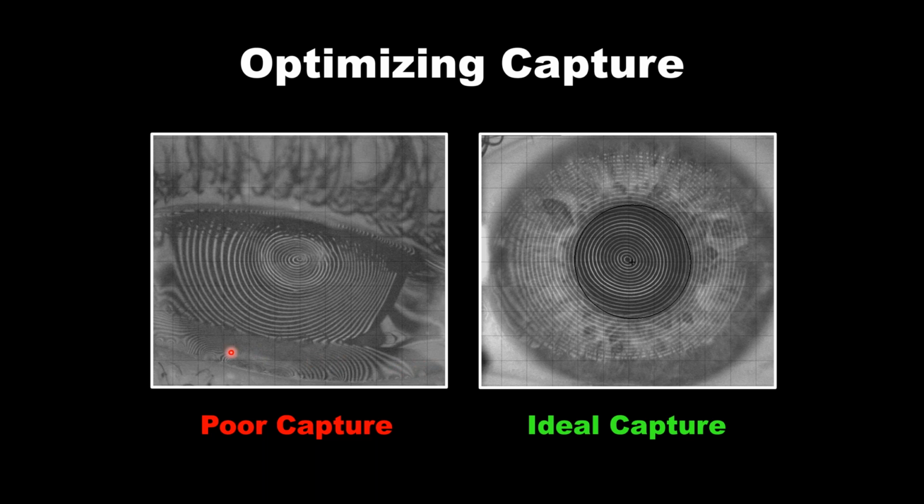So we need to get rid of this huge lacrimal lake down here, and just pulling down on the cheek is one way you can move that lake out of the way. Now, the upper lid is also a problem, covering much of the superior cornea, but then you see these long eyelashes creating shadows across the surface. So that is really giving us a very small area of information.